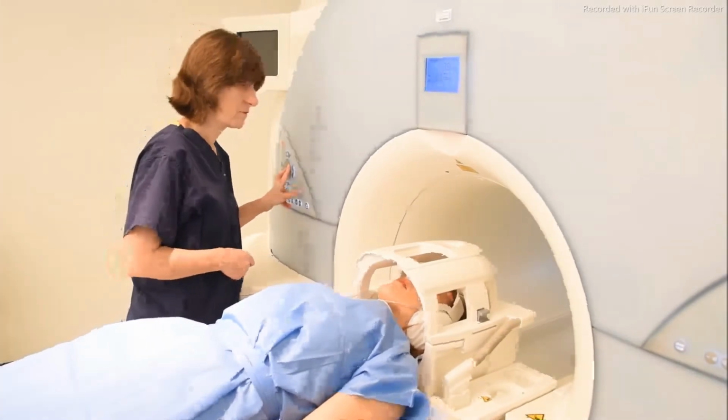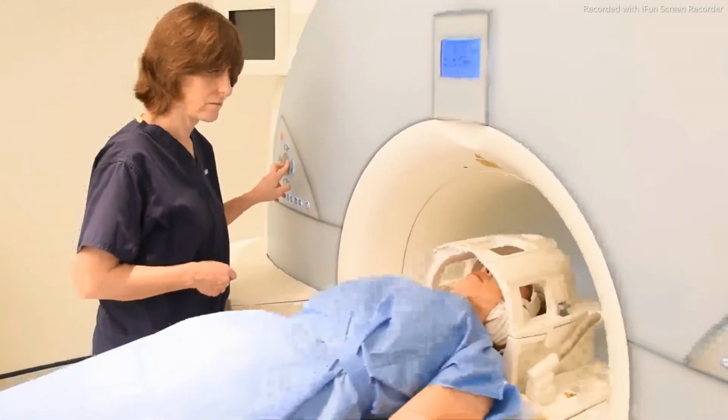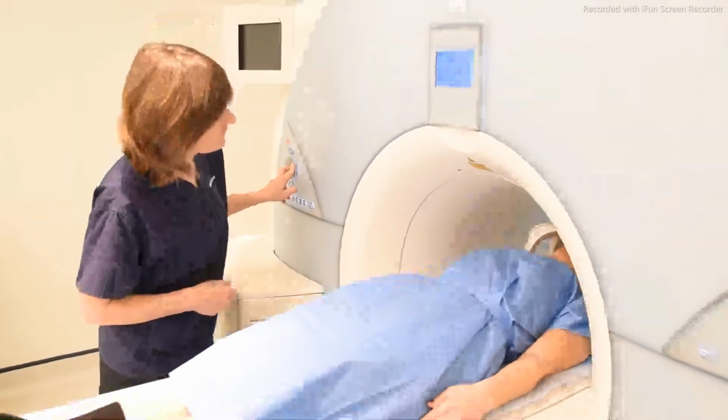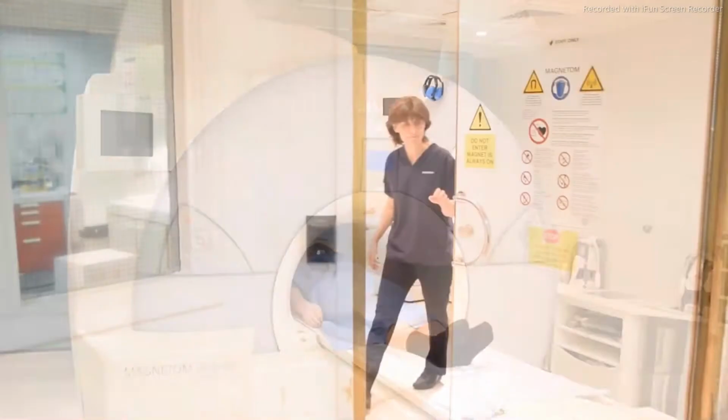Center to the glabella and move the patient carefully into the scanner. Make sure they're calm and comfortable before you leave the room.